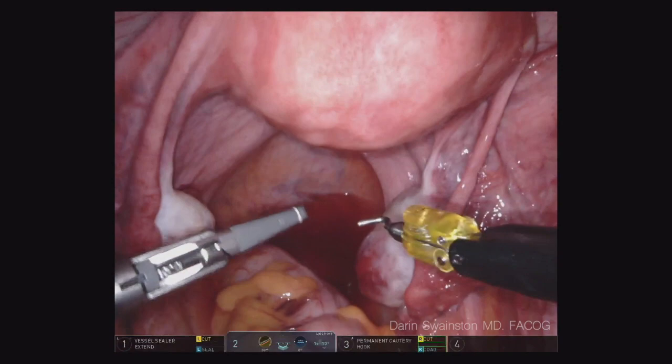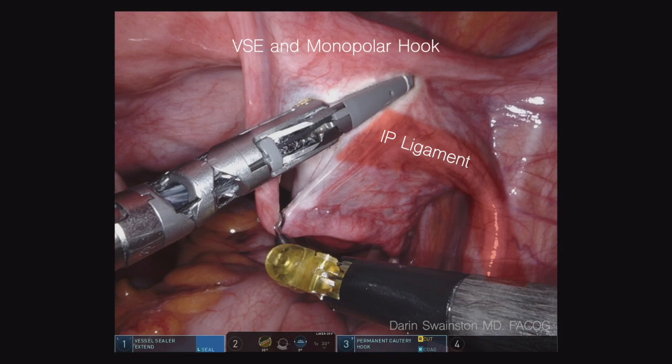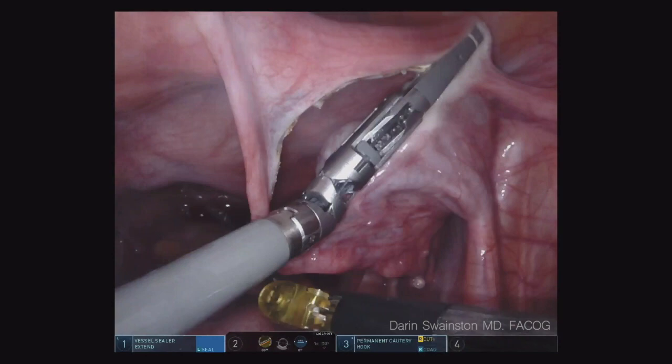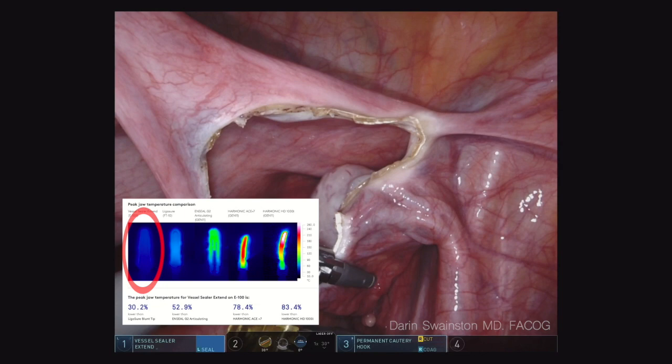You can see the back of the uterus there. That uterosacral ligament I want to keep intact, so I do a dissection line higher. I start off with a small incision of the mesosalpinx and I use a hook and I pull it down medial, and I take that vessel sealer extend and I move it up and lateral. That takes it away from the ureter. It also keeps the tissue inside the vessel sealer as it works — it's a very efficient, advanced energy, definitely more efficient than traditional bipolar because it has a blade inside and does both at the same time.